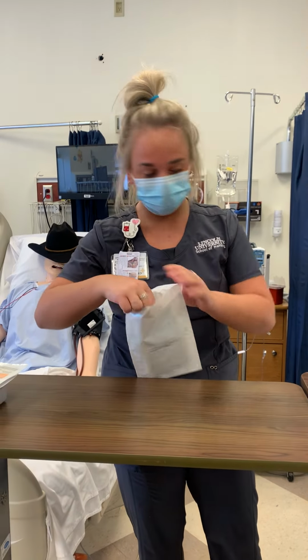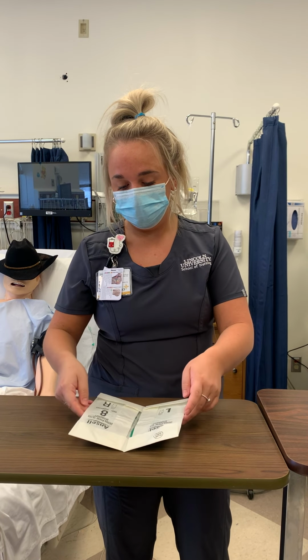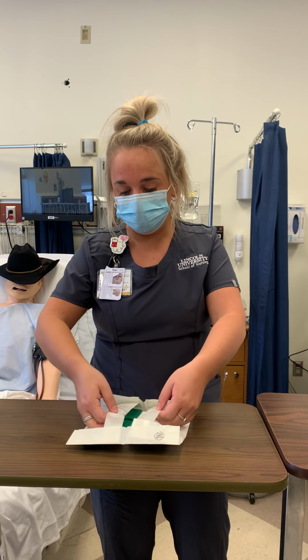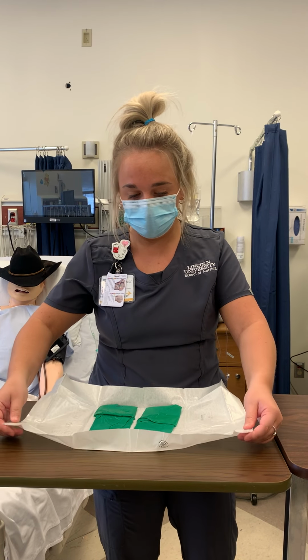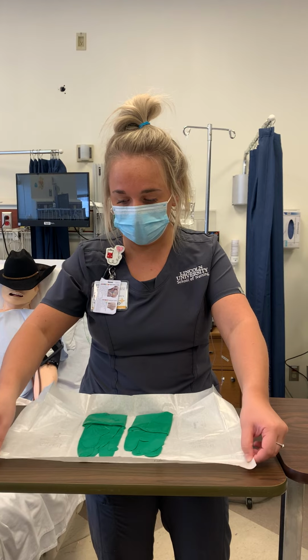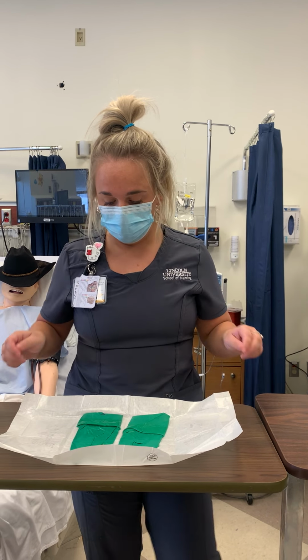Okay, now I can put on my sterile gloves. Making to stay in that 1-inch border. Okay.